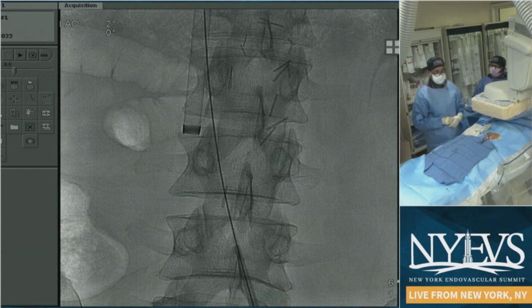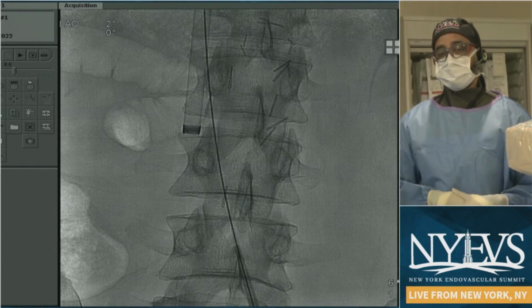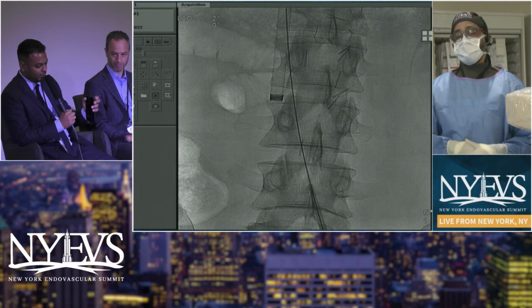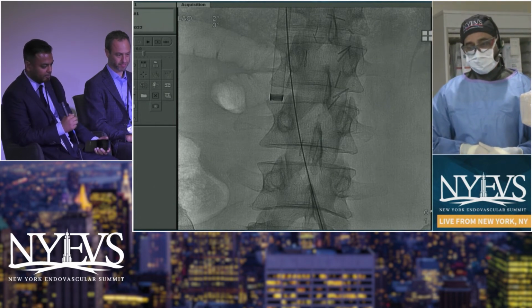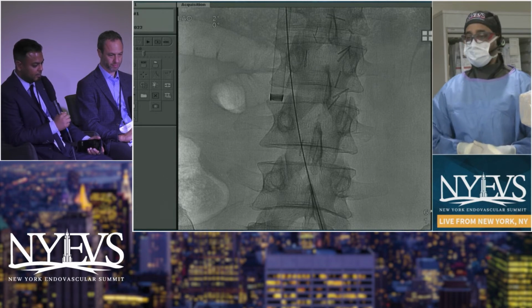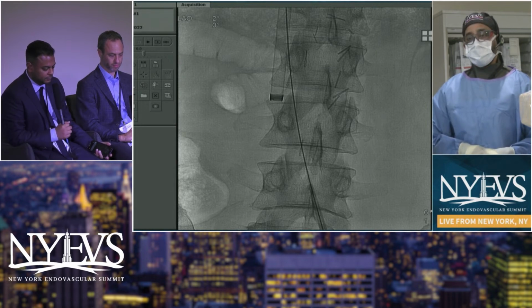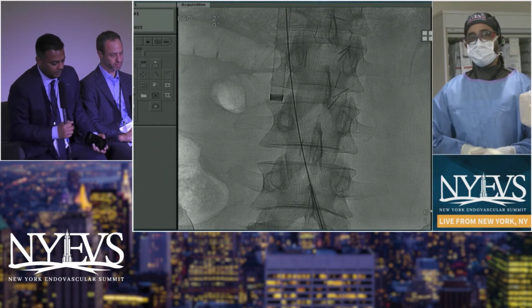If this was one of those closed cell filters, like an Option or a Tulip, have you ever had an issue with the wire going through one of those loops, so the wire becomes part of the complex with the filter when you're trying to collapse it? In those cases, I'll tend to leave a micropuncture in the groin and then leave a safety wire up. But for these ones, a safety wire down is usually not an issue. Right? But with a Trapease or something like that, it can be a big pain.